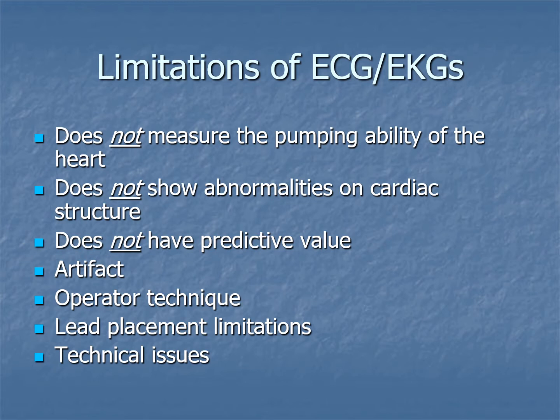The FloTrac and the Cheetah have the ability to measure cardiac output with pretty close accuracy. You also have Swan-Ganz catheters that aren't commonly used, particularly outside of a cardiac care unit, but they can pretty accurately measure the pumping ability of the heart as well, certainly cardiac output.